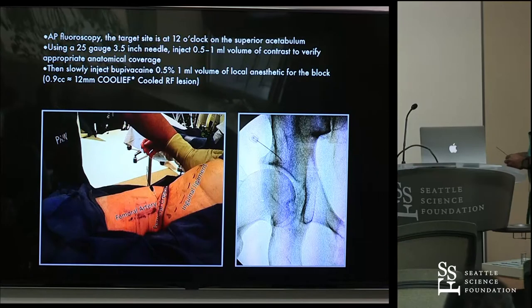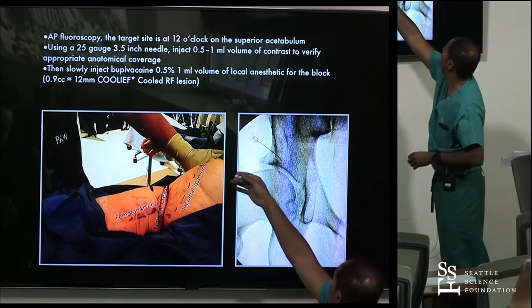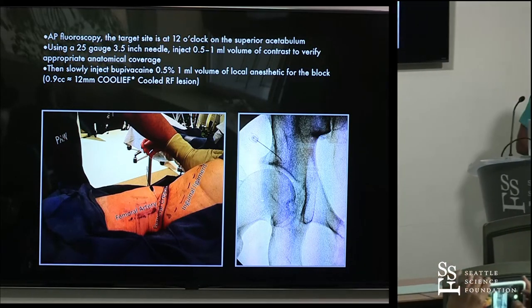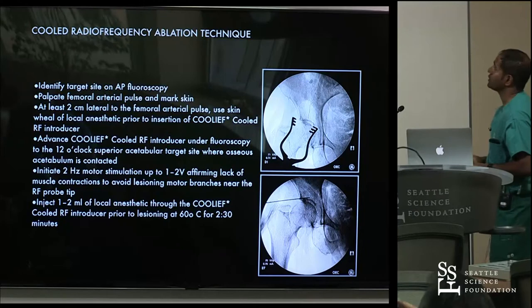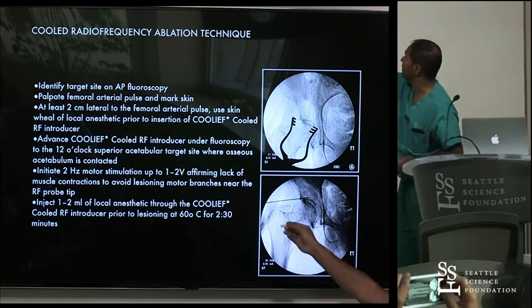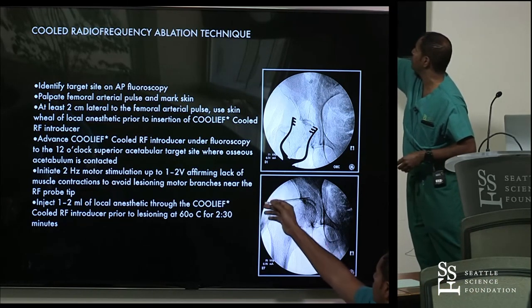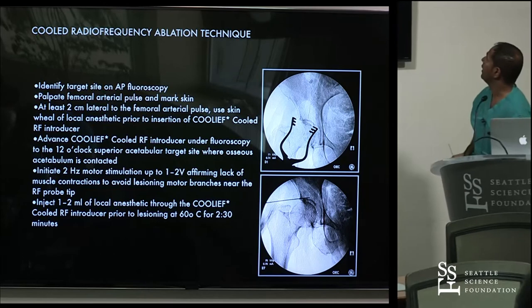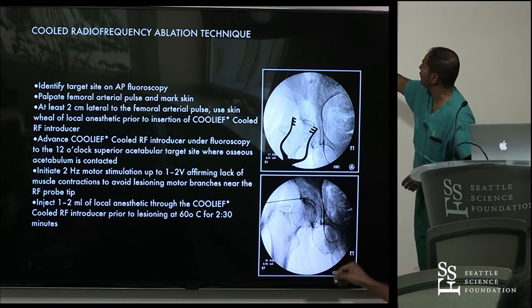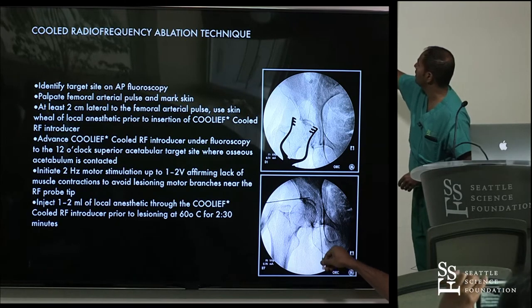With needle in place, everything marked out, here we see a diagnostic block, again at that 12 o'clock position of the acetabulum. For the cooled radiofrequency technique using the 17-gauge, it doesn't matter exactly how you angle in as long as your target point — the radiopaque marker of the probe — is at the 12 o'clock position. Come in inferiorly, touch down the inferior ramus, and then walk your way up. We want one lesion point inferior to the incisura and one superior.